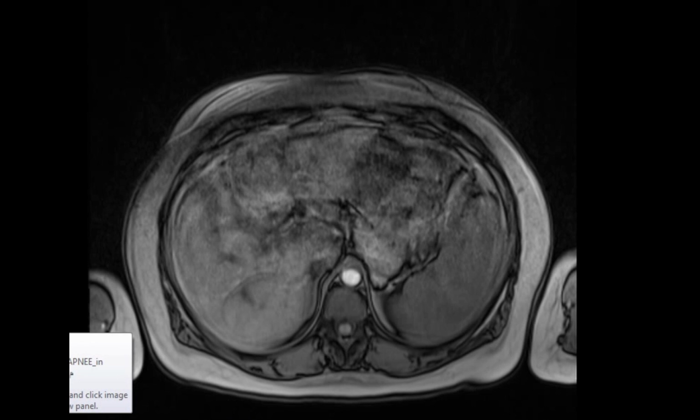Whether it's trichobezoar or phytobezoar, I don't know, it's not my concern. It's a bezoar, okay? And that's why the ultrasound was normal. It needs a big experience to diagnose bezoar by ultrasound.